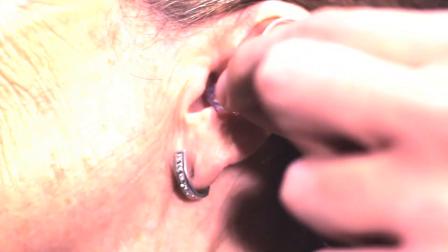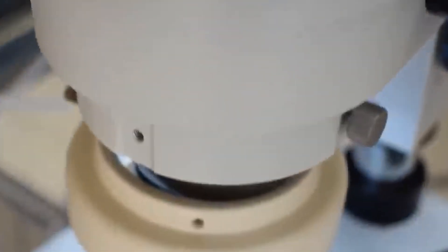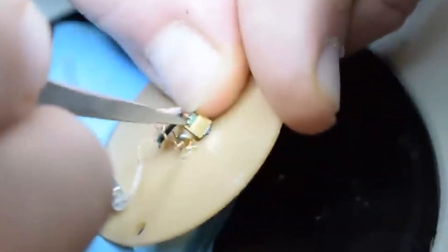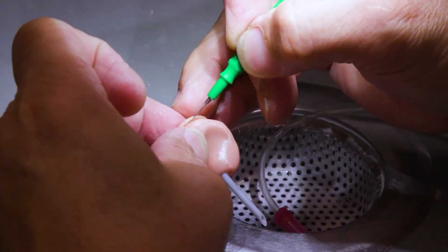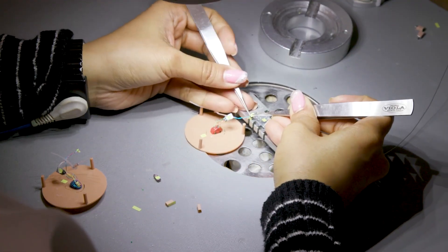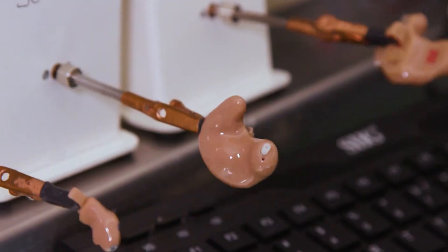Depending on the type of hearing aid, batteries can be disposable or rechargeable. The components and circuits are run on a ceramic substrate base of various designs. The substrate is made using a screen printing technique that alternates layers of conductive and insulating materials. The conducting layers contain gold and silver, and the insulating layers contain silicone compounds. Between the printing of each layer, the substrate is passed by a conveyor through a furnace, where it bakes for two hours at 850 degrees Fahrenheit or 454 degrees Celsius. This seals the layers and creates the color patterns characteristic of printed circuit boards, only on a smaller scale. The various electronic components are bonded by hand to the gold and silver parts on both sides of the substrate, interconnected using gold wire of 0.001-inch or 0.025-millimeter thickness. Lastly, the components are sealed in an epoxy paste and heat-hardened.